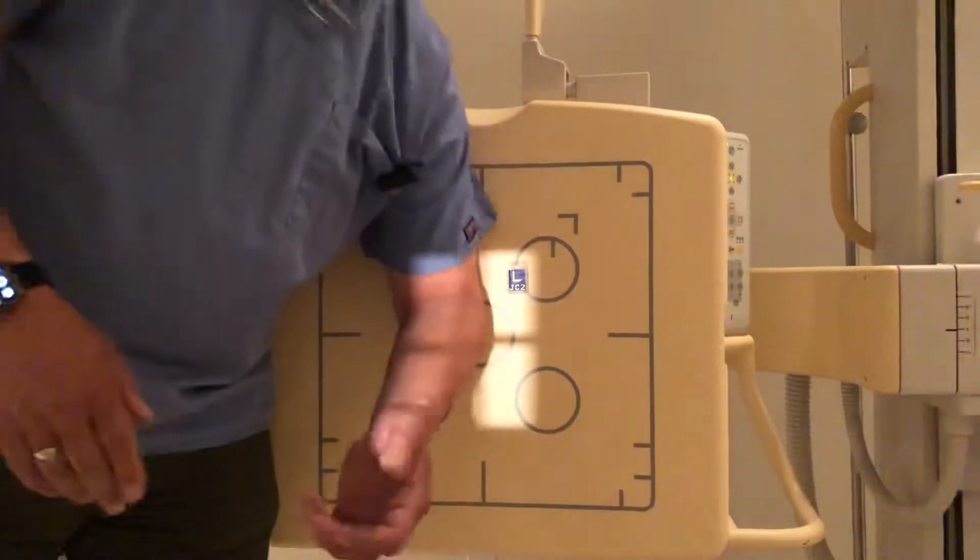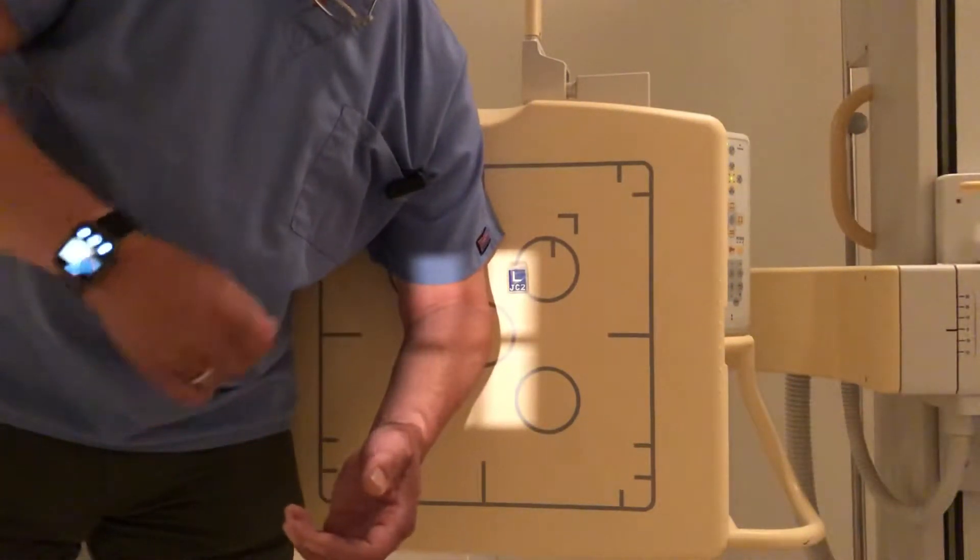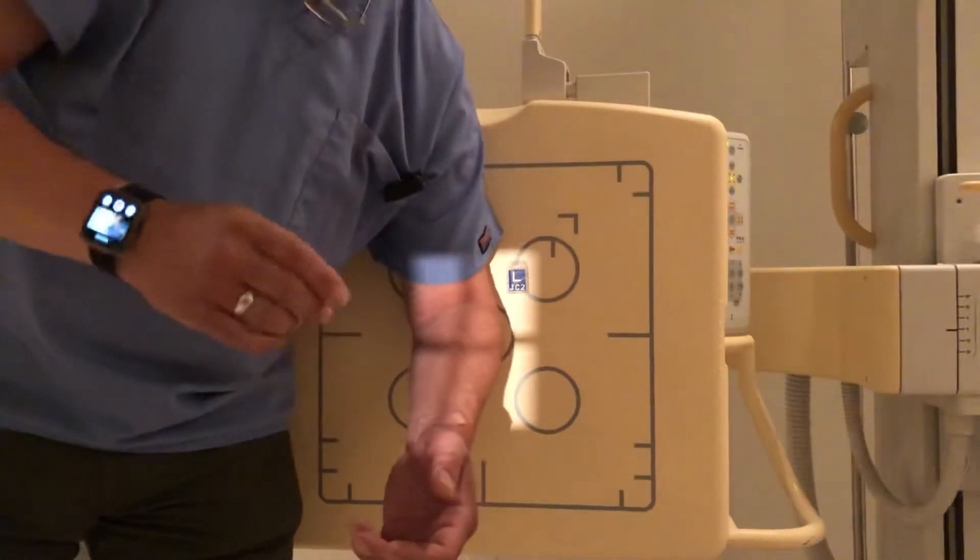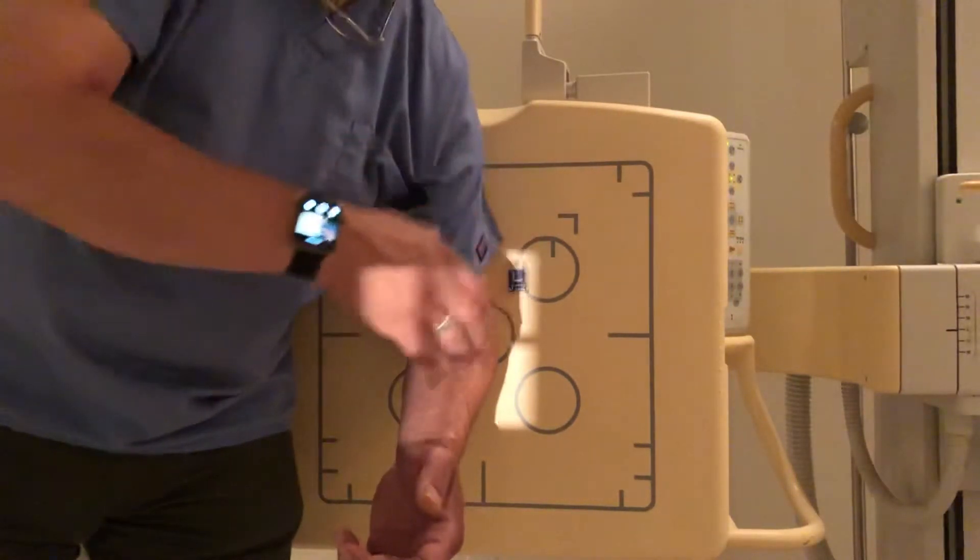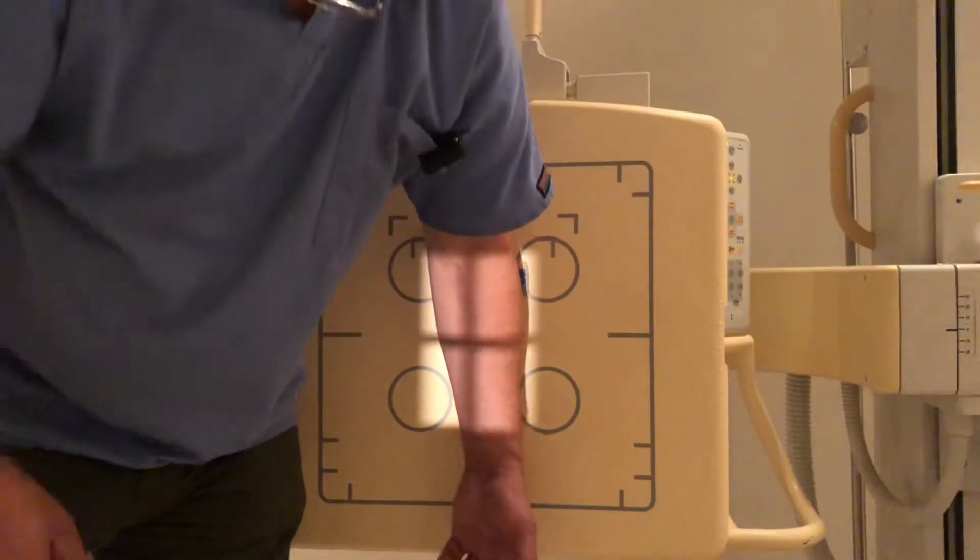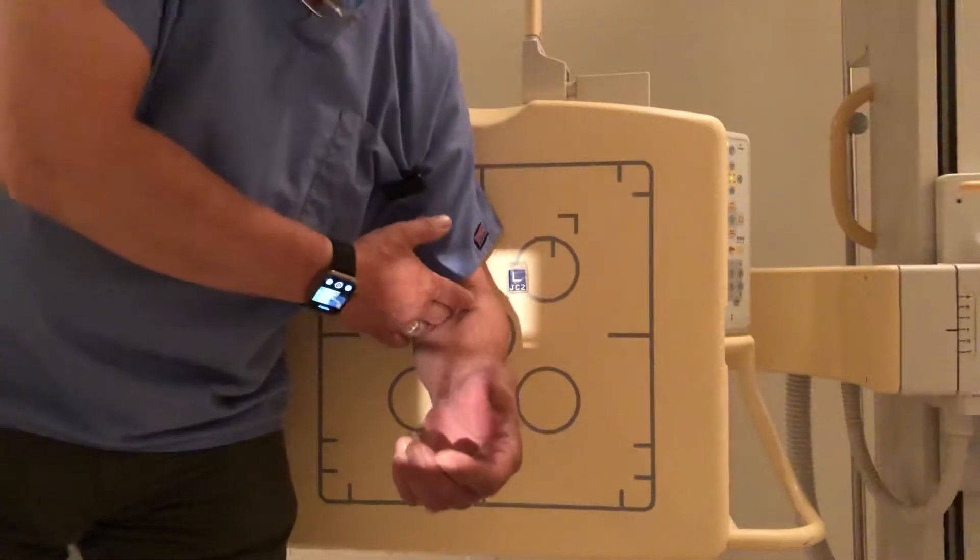Okay, so in this position when they're flexed, you're going to take two APs basically. You're going to take one of the humerus and then you're going to take one of the forearm. Distal humerus, proximal forearm.